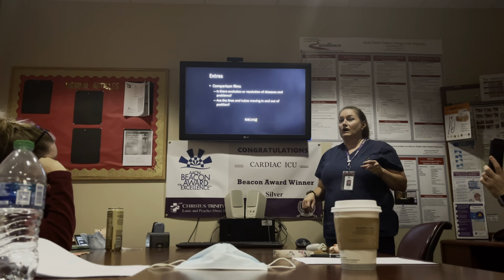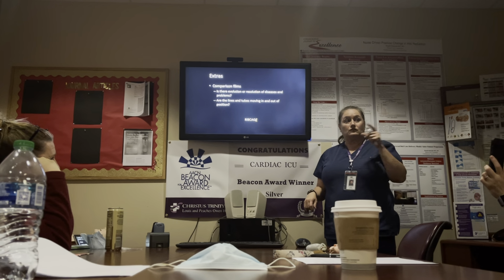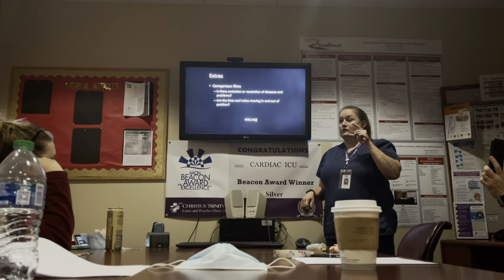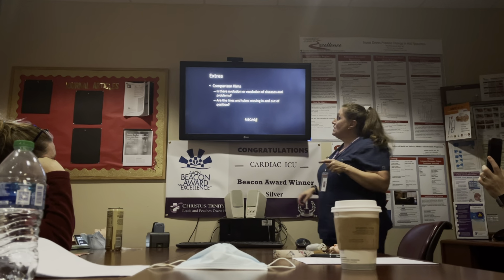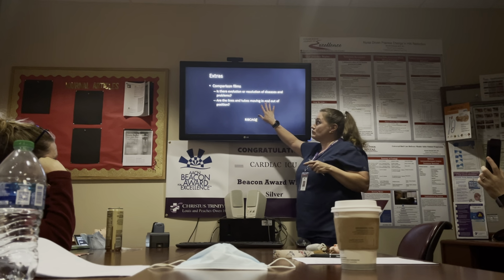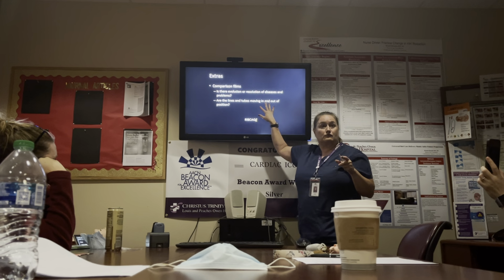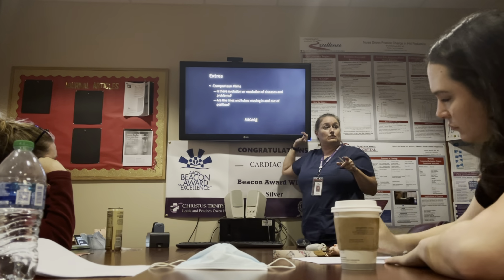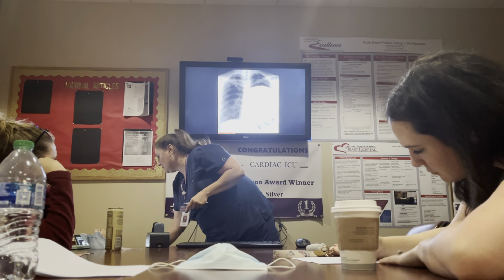How many times have we lost central lines moving them around, even in the bed, with radiology coming in and moving them? So again, we just need to make sure that if you need a comparison film, let us know, and you guys are good about that when you think that something's moved and you want to make sure that it's still in place. Okay.